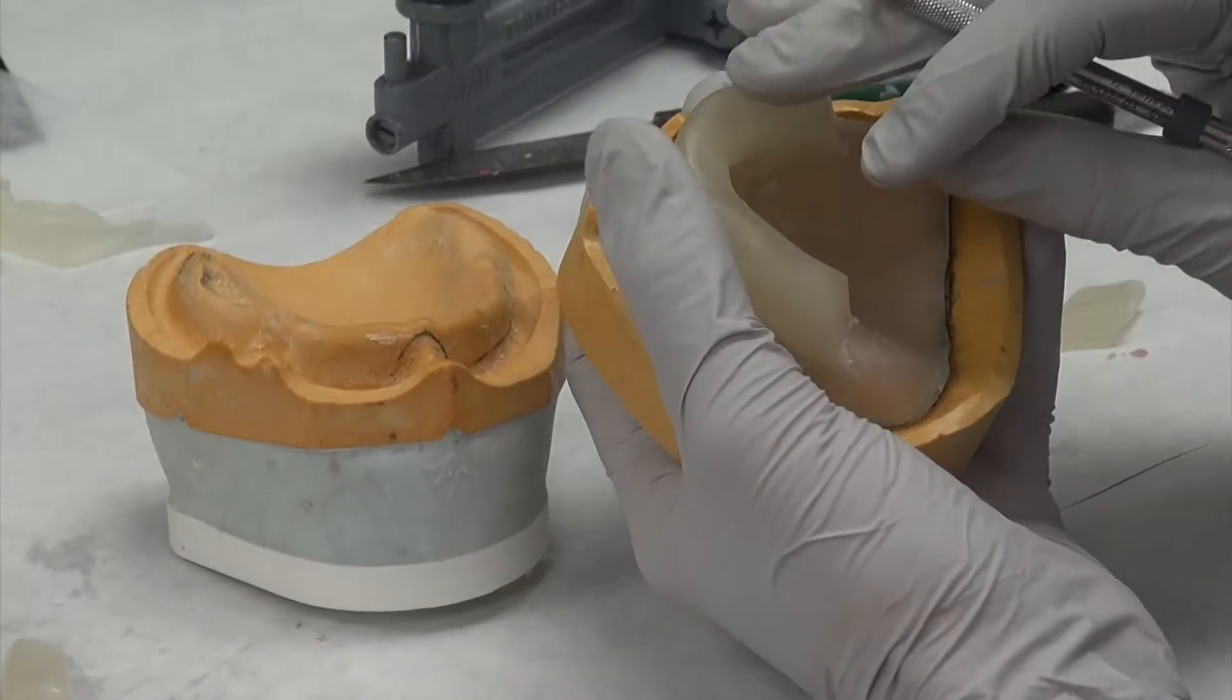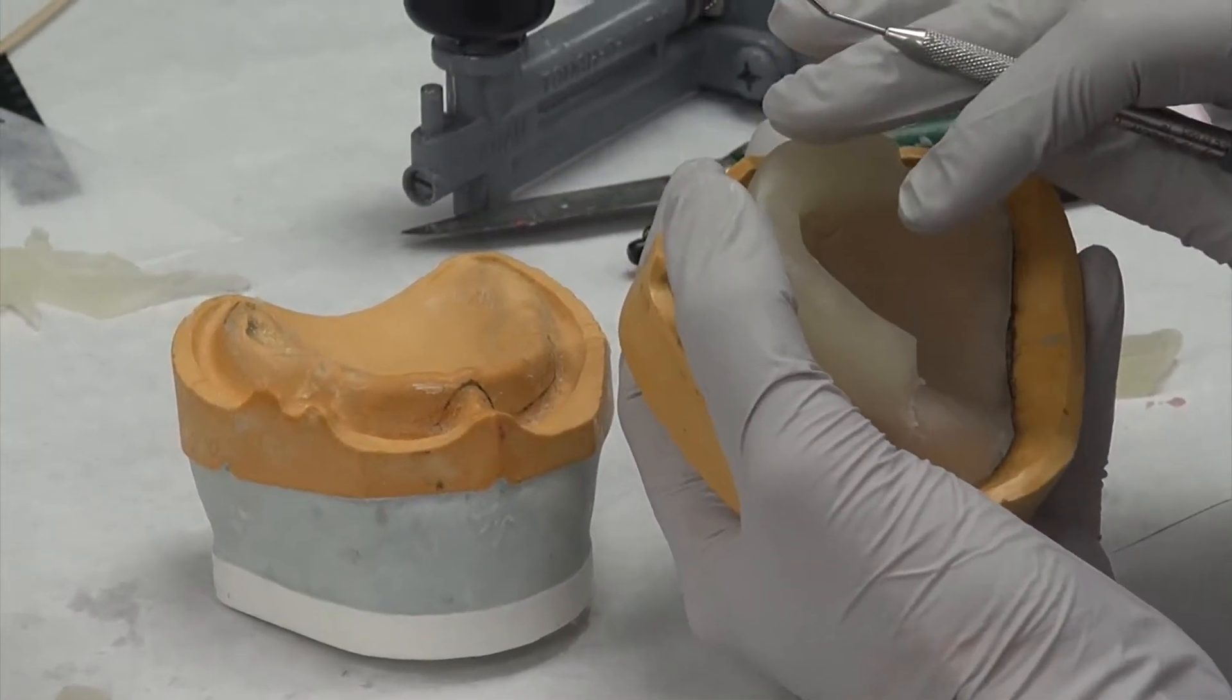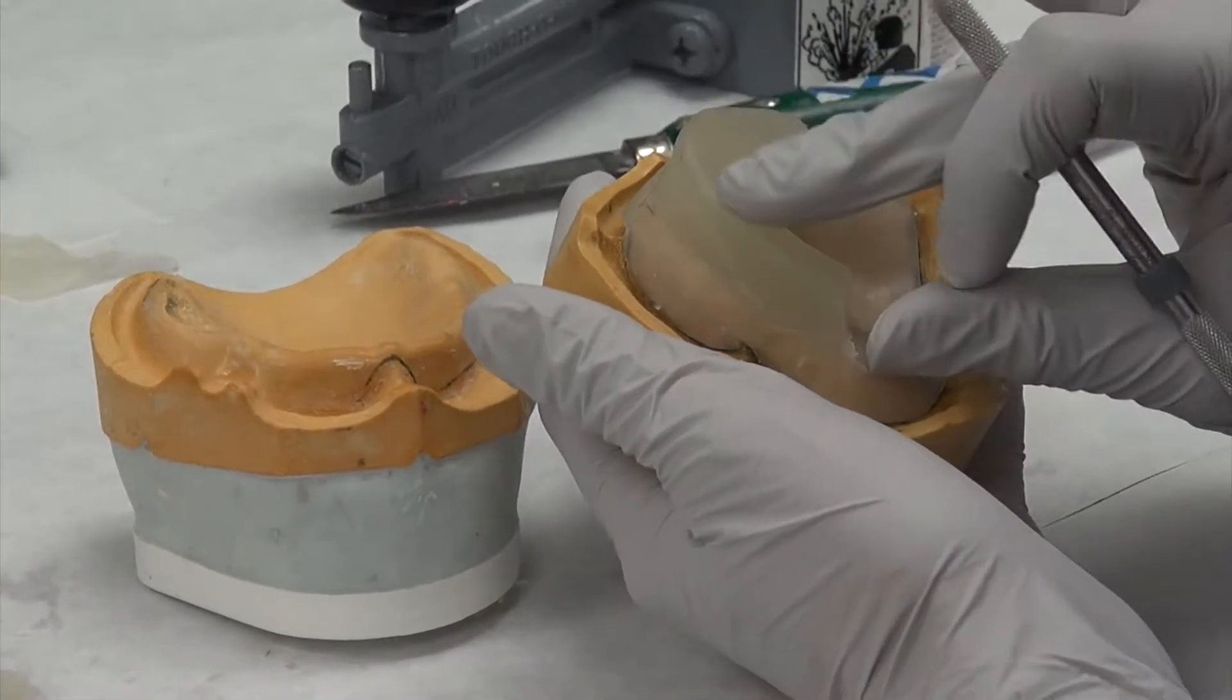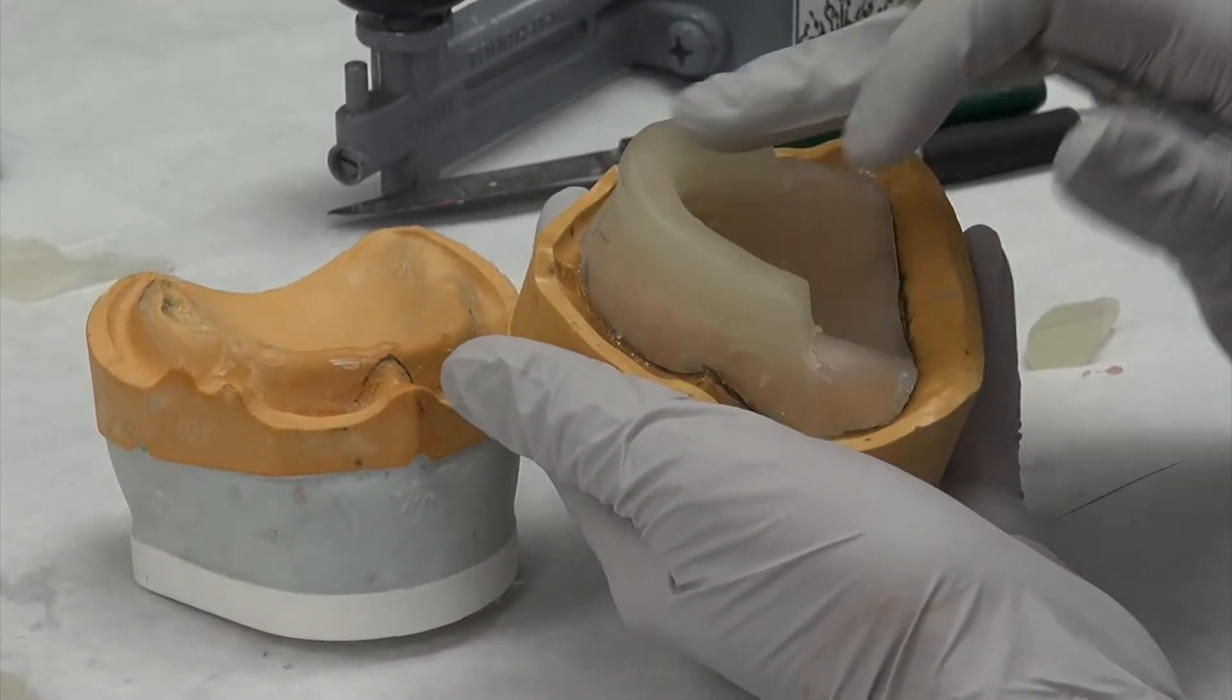Essentially the handle is kind of simulating where the teeth will be. When you do the record bases, eventually you'll add wax to simulate where the handle is. So see how they're all kind of building on each other.